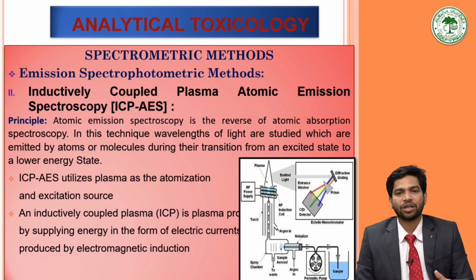So, the principle of atomic emission spectroscopy fundamentally consists of three general steps: the breaking of the sample into its constituent atoms, which is atomization; excitation of the atoms; and the emission as electrons fall back into their original orbits. Of these, the first step, atomization, is used in atomic absorption spectroscopy as well. Atomization should be produced with a minimum ionization of the elements to be analyzed. It can be done by a number of methods, like heating the sample to a higher degree.